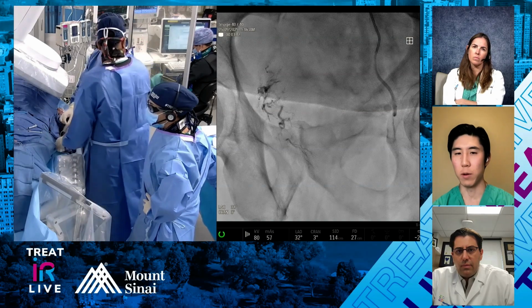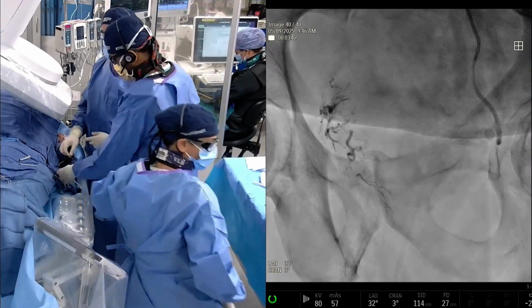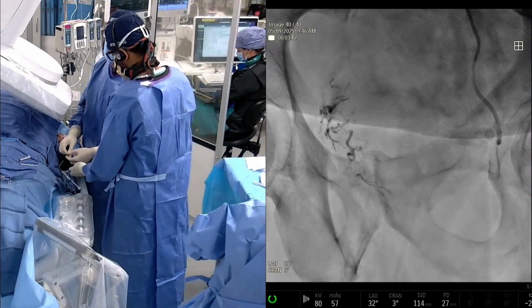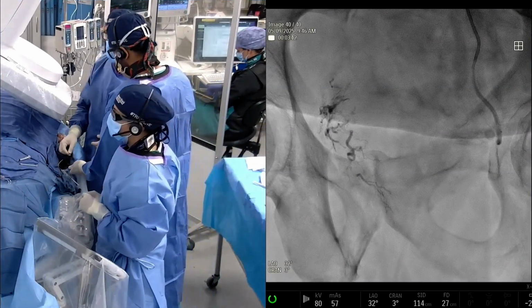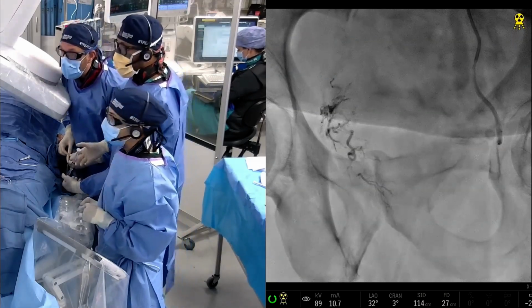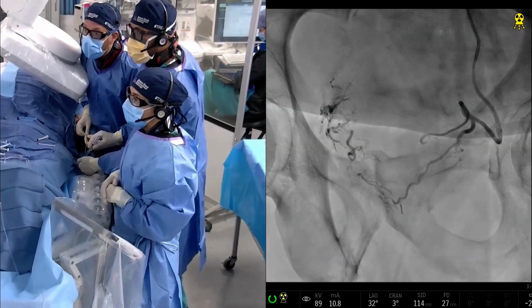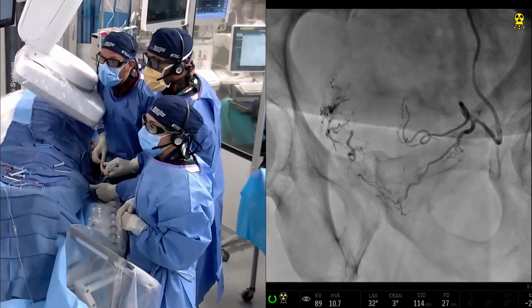Yeah, we're going to inject a little bit faster on this side than we did on the other side because I think we feel pretty safe in this location. So we're going to go pretty quick. We're going to try to get it to perfuse that middle branch or that superior branch that's going to the middle part of the prostate. And so this is sort of a two-handed or four-handed operation. There we go. Beautiful. Beautiful.